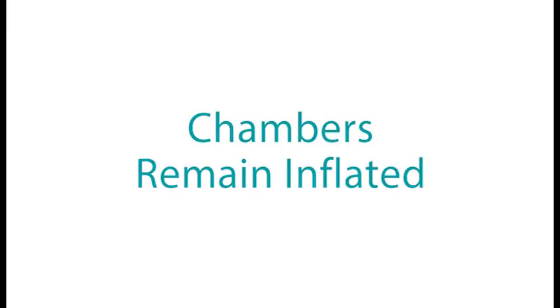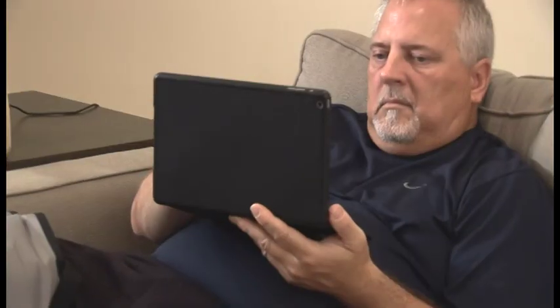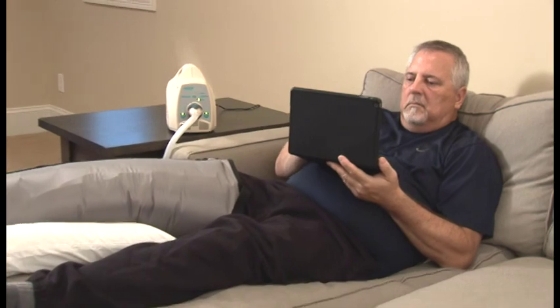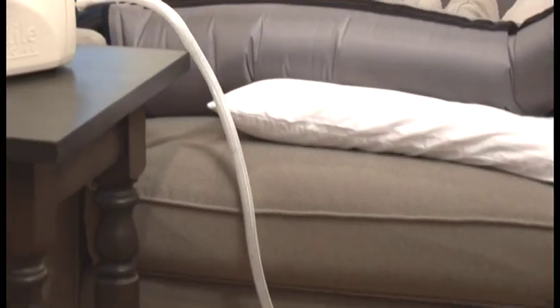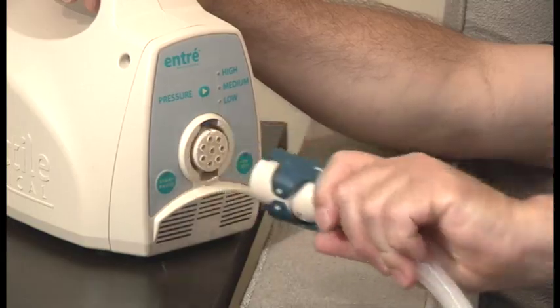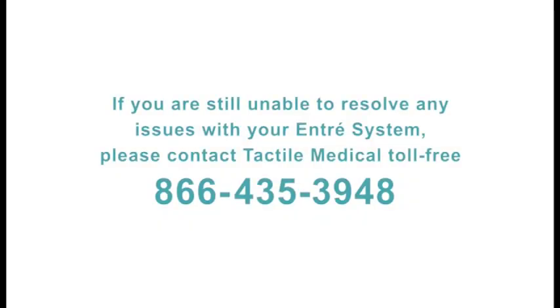If chambers remain inflated: it is normal for a small amount of air to remain in the chambers between inflations, giving the garment a puffy appearance. If the chambers remain fully inflated, ensure that the tubing is not kinked or pinched, then disconnect the connectors and the chambers should deflate. If you are still unable to resolve any issues with your ENTRE system, please contact Tactile Medical toll-free at 866-435-3948.